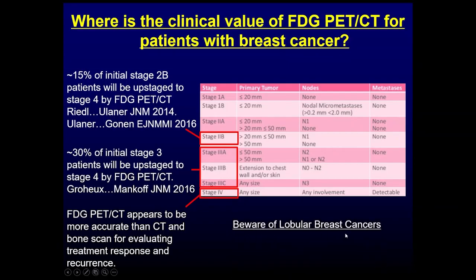The warning: beware of lobular breast cancers, which may or may not be FDG avid, so lobular breast cancers can be missed on FDG PET. Here's a review article which I published talking about additional factors for the clinical value of FDG PET-CT in patients with breast cancer.